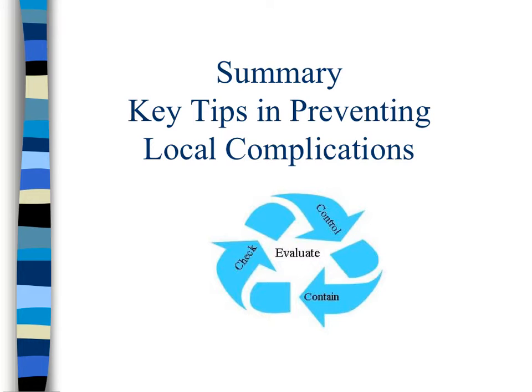We must maintain universal precautions and be cognizant of our hand washing techniques and wearing clean gloves. We need to select dressings appropriately, and our taping technique needs to ensure that the catheter is adequately stabilized in place to minimize catheter movement within the vein, but allowing for good visualization of the site.